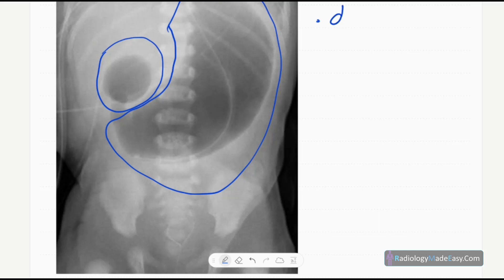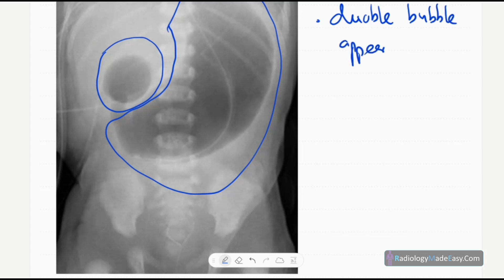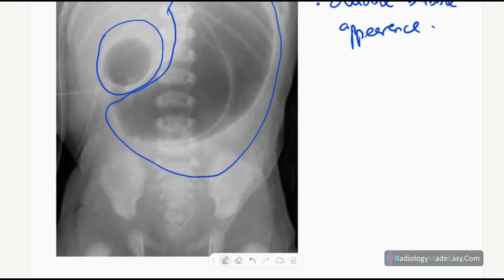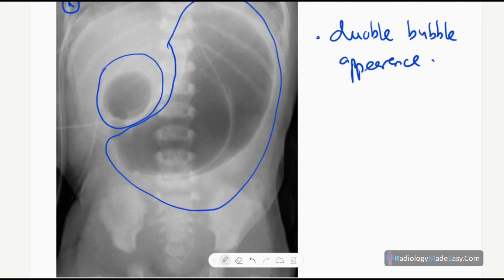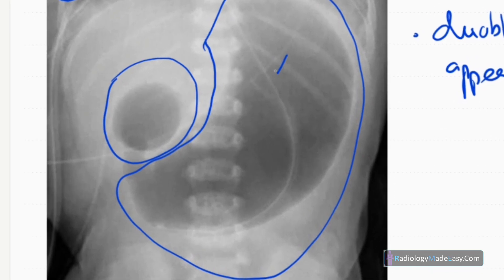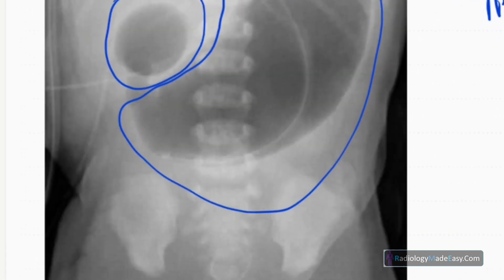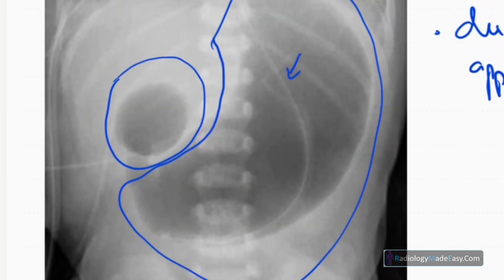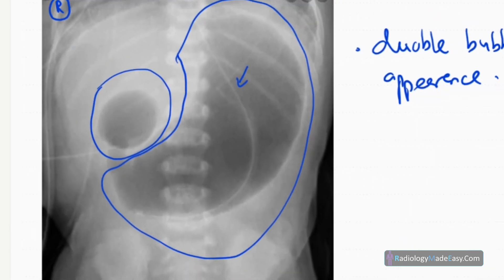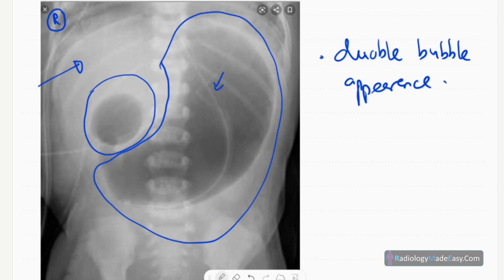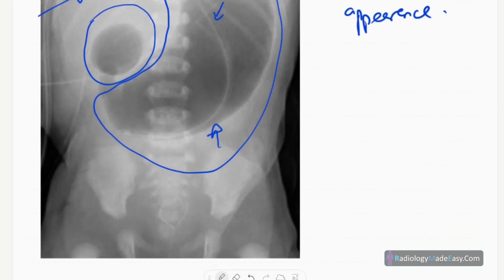We call this the double bubble appearance — a unique radiological feature. You can also see an NG tube inside. There is no evidence of intraperitoneal free air, no portal venous gas in this region, and no obvious pneumatosis in the stomach.